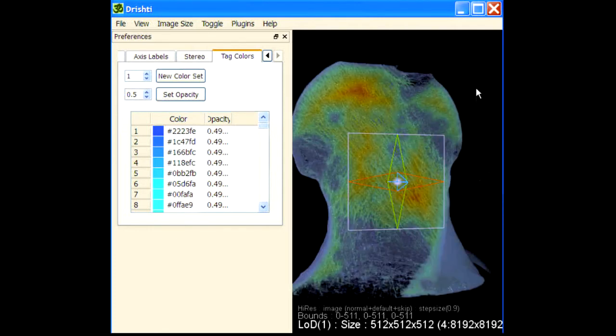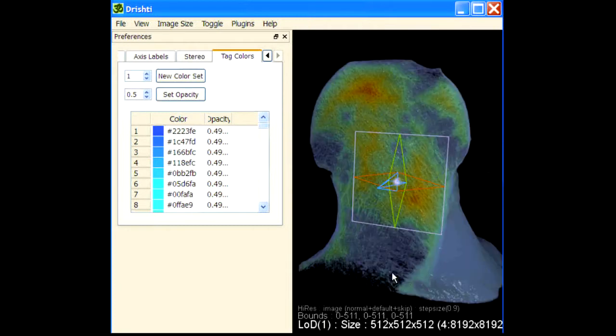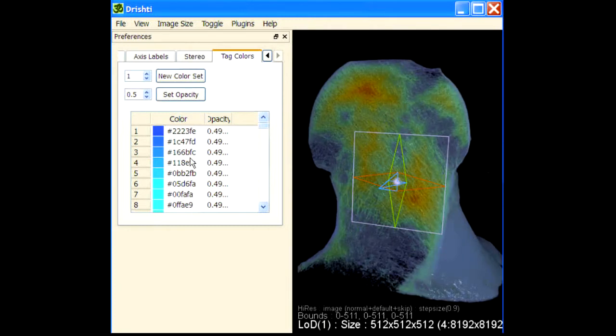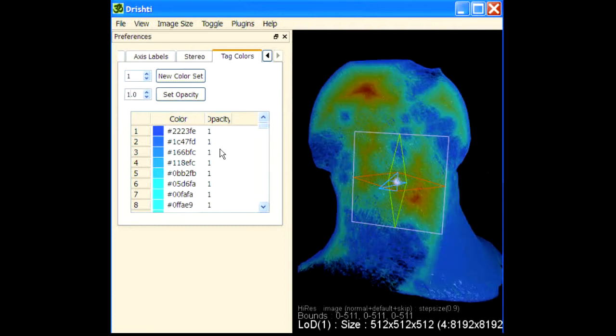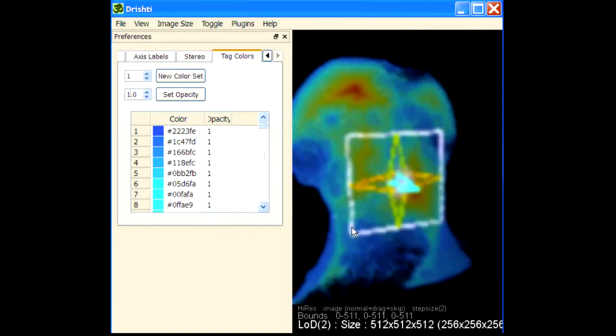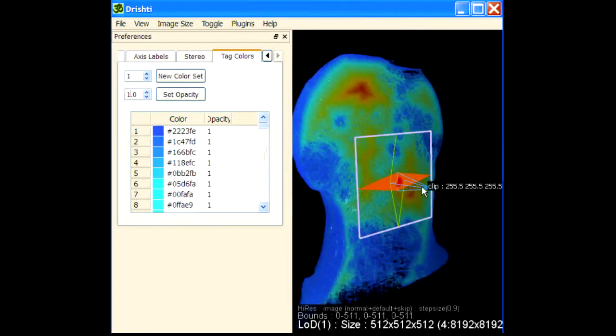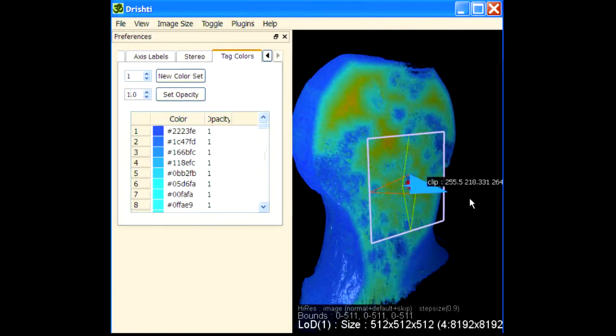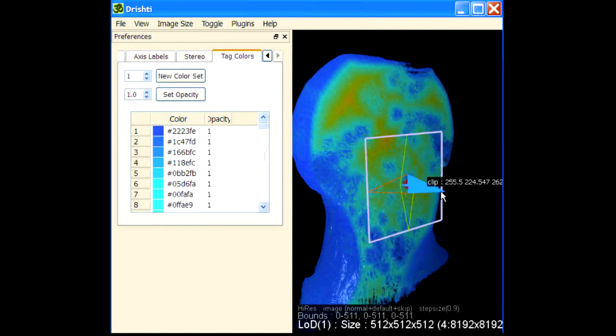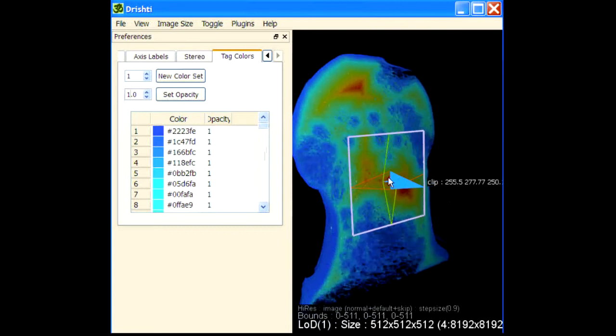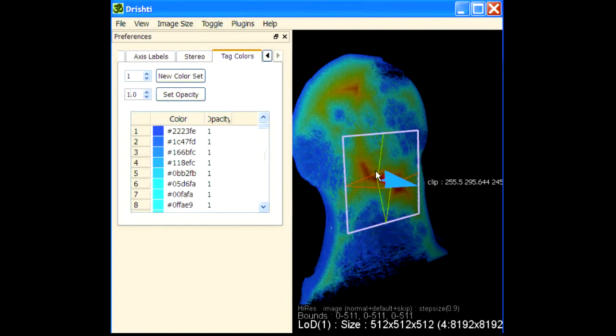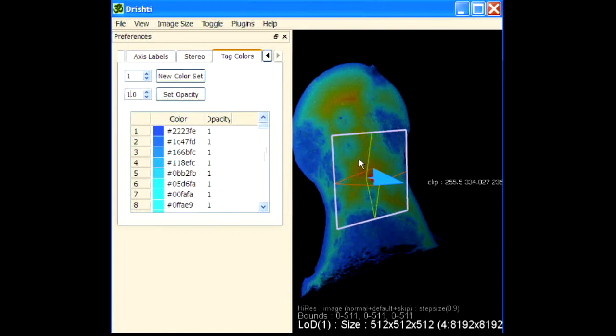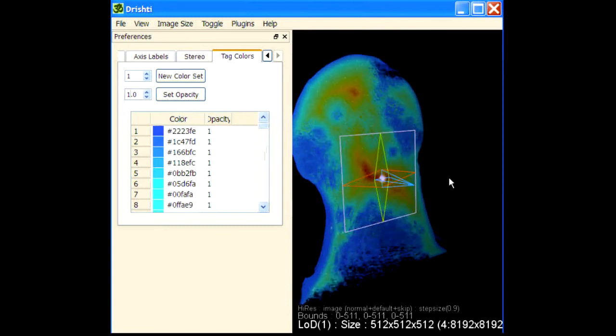Whatever is in buffer channel 2 basically acts as a lookup table for channel 2. Let's change opacity to 1, set opacity. Everything is set to 1. So the red areas now are where you have the thickest opacity, the thickest region in your data based on the current transfer function.